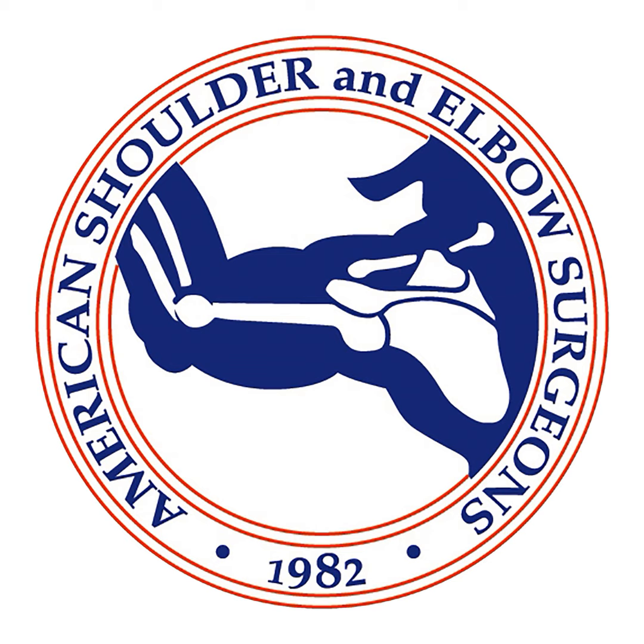I think it's frankly faster for me. I don't have to do all the circular reamers and broaches. Less blood loss, and a number of surgeons also say less pain because you're not violating the canal. So those are some of the reasons for stemless. I think that makes it a very attractive option in my practice.